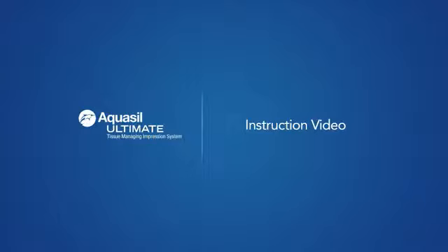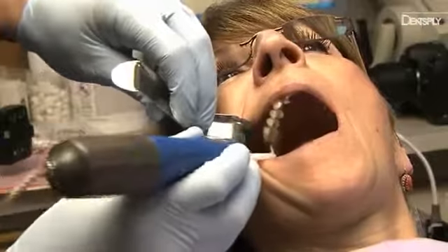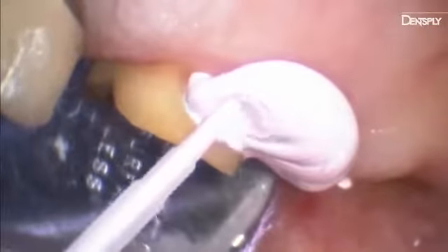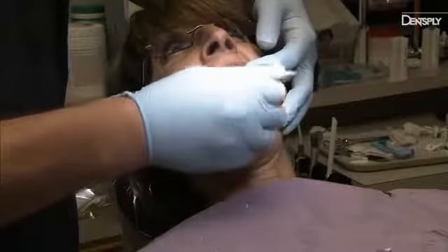Welcome to another First in Dentistry from Dentsply. Introducing Aquasil Ultimate. This revolutionary dental breakthrough combines tissue management and impression making into one process. This new technique doesn't require the use of retraction cord or paste, resulting in a faster, easier, and more predictable impression procedure that's less traumatic for patients.